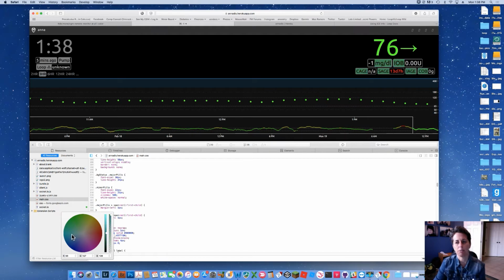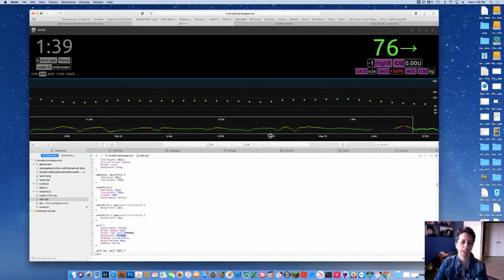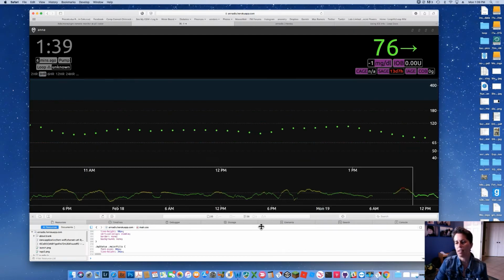Maybe you say, yeah, you know what? I really wanted more purple in my site. So you say, yep, that's the purple I want. I want that purple color to just pop out. I feel better about it. So all the colors are translated into hexadecimals and it comes out as 7F1D80, right? Nerdy, but that's the way the colors are translated into this 6-digit color code. So now that we've selected that code and I kind of like how it looks, I can get a preview. Yeah, that looks cool.